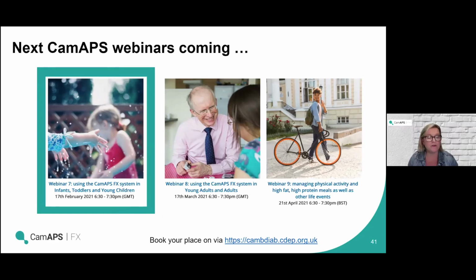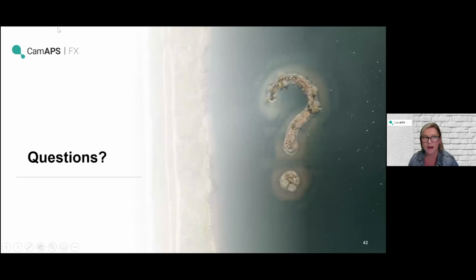No, absolutely. We've got a few questions and I'm sure there'll be some more coming. But the first question is around the use of Boost. Helen, you mentioned using Boost overnight, after the evening meal. And there's a question around, if you've got Boost on, the system generally doesn't learn in the same way as it would when Boost wasn't on. What's your comment on, is it worth missing out on the learning and using Boost? How I tend to think of it is that most of what happens after meals really depends on the bolus dose, more so than the basal insulin.